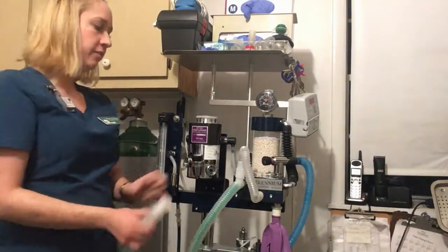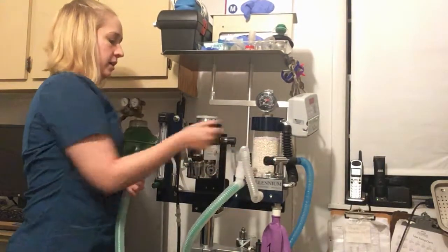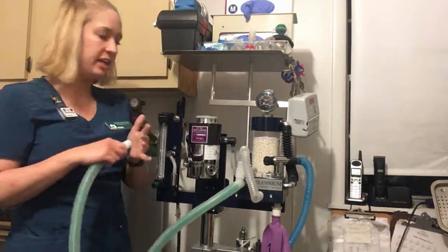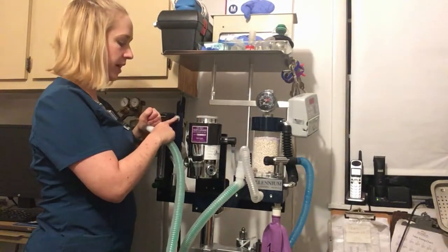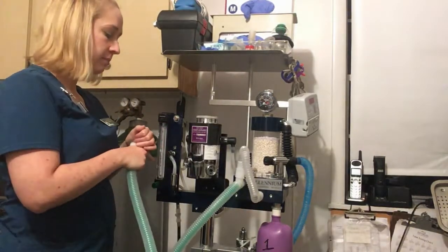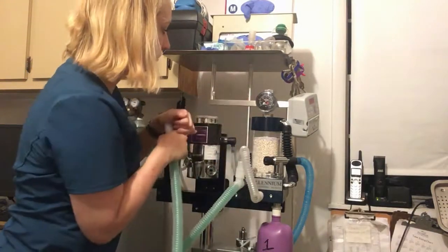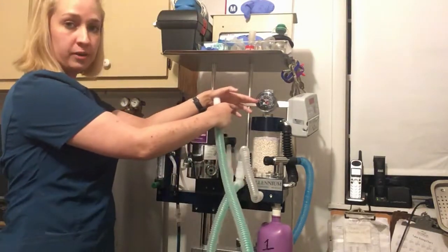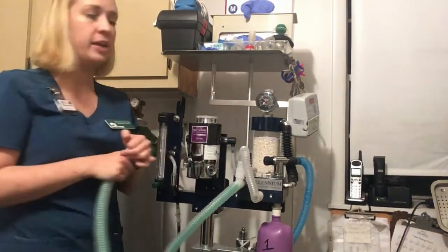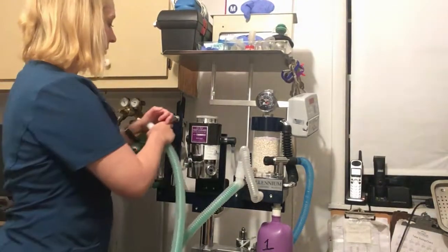When you're testing for leaks, the first thing you're going to do is close off this pop-off valve. Next, you're going to close the end of the circuit with your hand, thumb, anything like that. Then you're going to flush the system with oxygen, filling up the reservoir bag completely. You'll fill up the pressure to about 20, where that pressure gauge says about 20. Then you're going to sit there for about 5 seconds, watching that gauge, making sure that it's not going down at all.